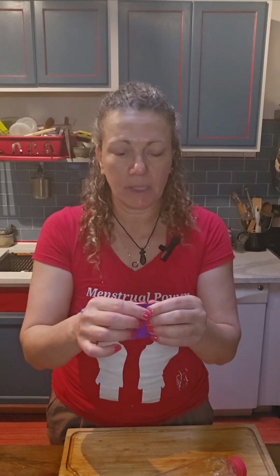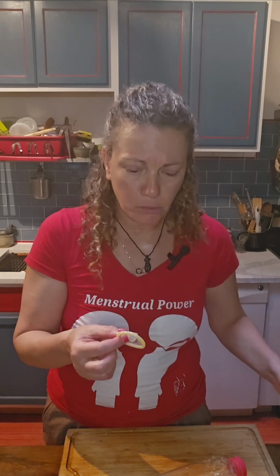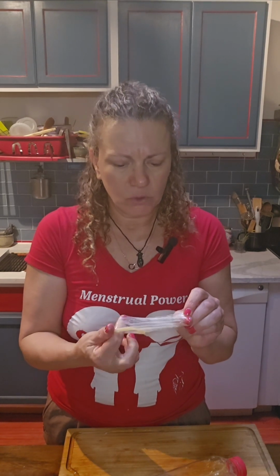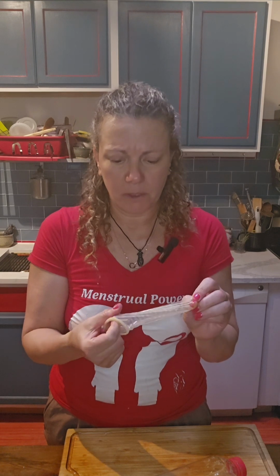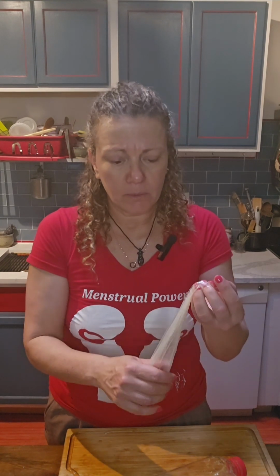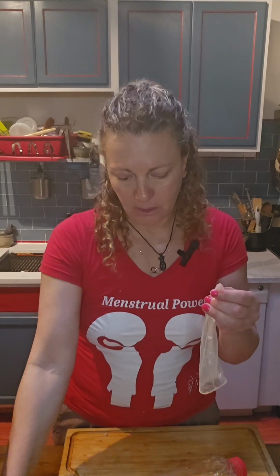This is a condom, any size. It doesn't really matter because we're going to stretch it. So you can use whatever brand. It doesn't really matter which one. And you can wash it so it won't be so oily. Try to buy a condom which is as transparent as possible, so the girls can see how we demonstrate the liquids.